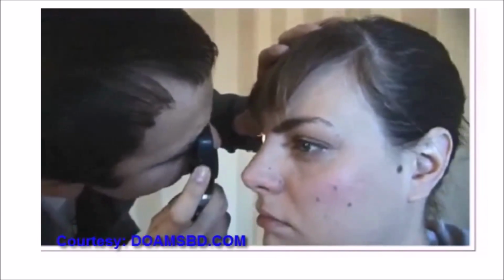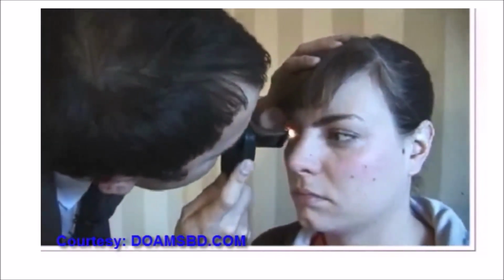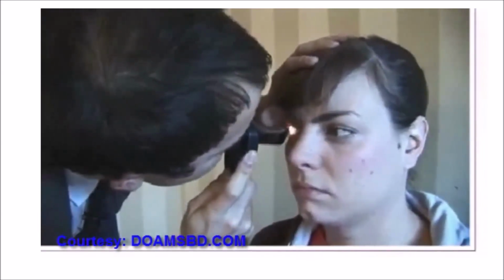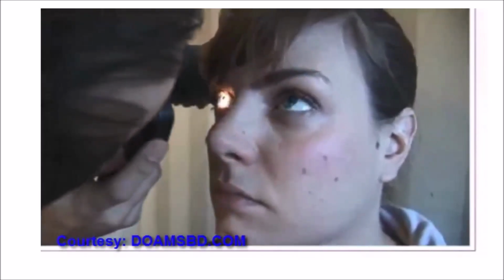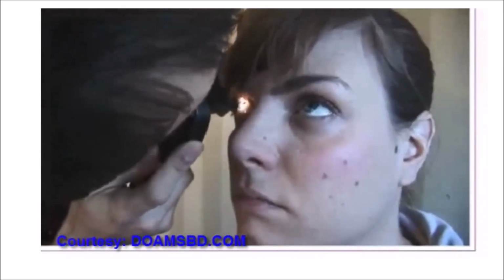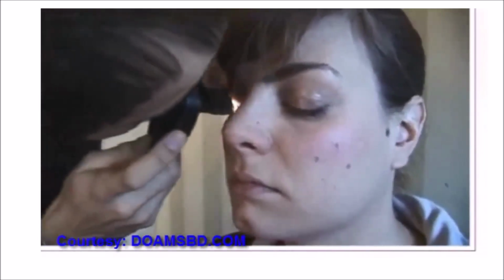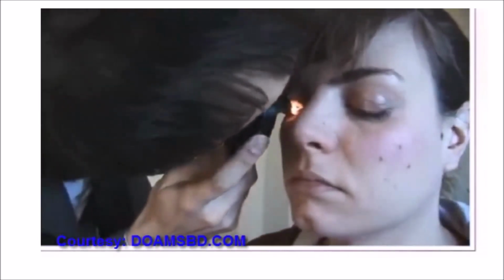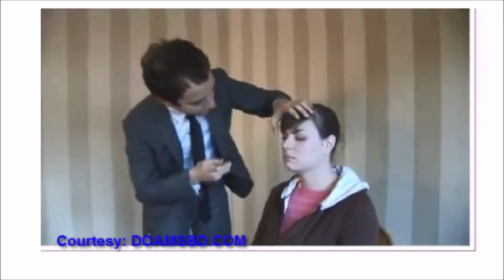Okay, Sarah, could I ask you to just look into my light for me, please? Thank you very much. Looking into the eyes means actually examining the macula. Can I ask you to look up to the ceiling, please? Thank you. And down to the ground, please. Telling her to look up and look down, across to the left, please.